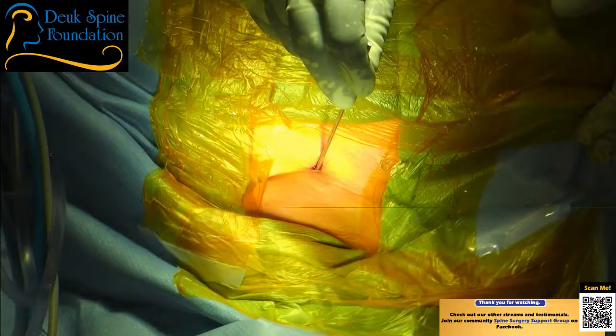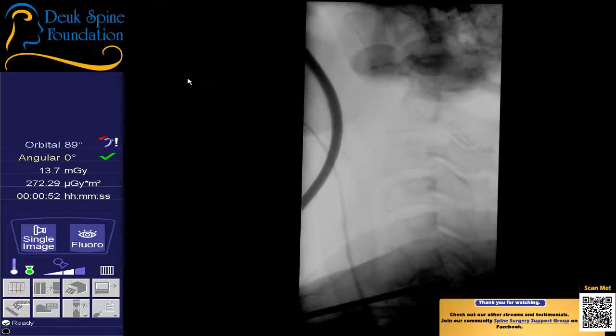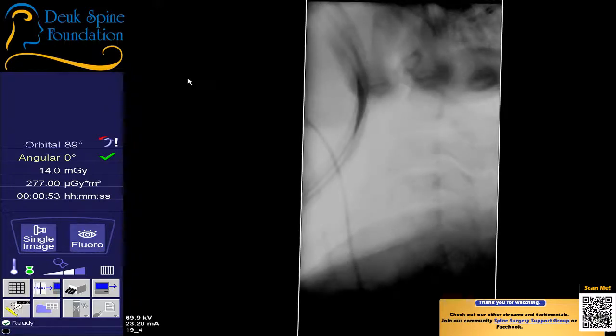Stay there, everyone, for just a moment. Mallet. We're going to advance this a little bit more. Shot. That looks good. Let's bring our tube down. Almost done. And the nice thing is her collarbone's a little lower than it could have been, which makes it a little better shot. Come south a little with your fluoro. Come south just a little bit and shot.